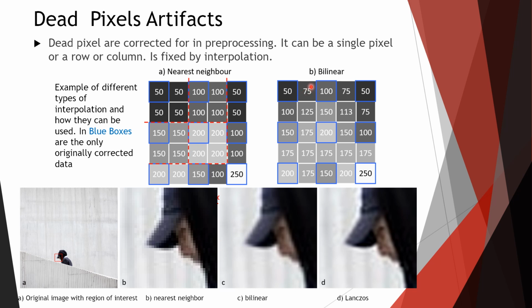It's fixing a dead cell, which is a del on the IR. So the del on the IR isn't working right here. There's no data that comes from it. In order to create the image, we're not just going to leave that blank, right? We're going to do the interpolation steps. And a lot of research is done on that for different manufacturers.